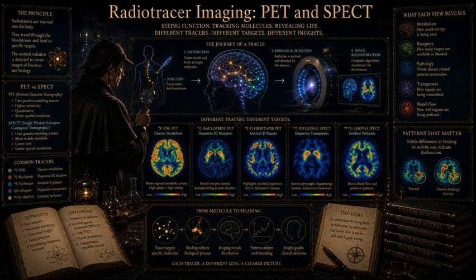Radioactive decay works the same way. We know the average rate of decay, the half-life. But the exact number of photons emitted from a specific cubic millimeter of brain tissue in a given second is a random variable that follows this Poisson probability curve. Okay, so how does OSEM use that probability to build an image?